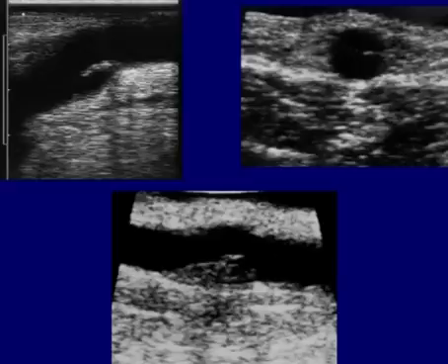And I mentioned valves, and here are various images of valves and valve leaflets that have been left over in an in situ bypass. Or you can also see valve remnants in reverse vein bypasses that become frozen and stenotic into the lumen. So here we see a valve, almost looks like the whole thing. Here in transverse, we can appreciate another valve. And in this patient, we see another valve leaflet that really looks pretty much like they missed the whole thing.